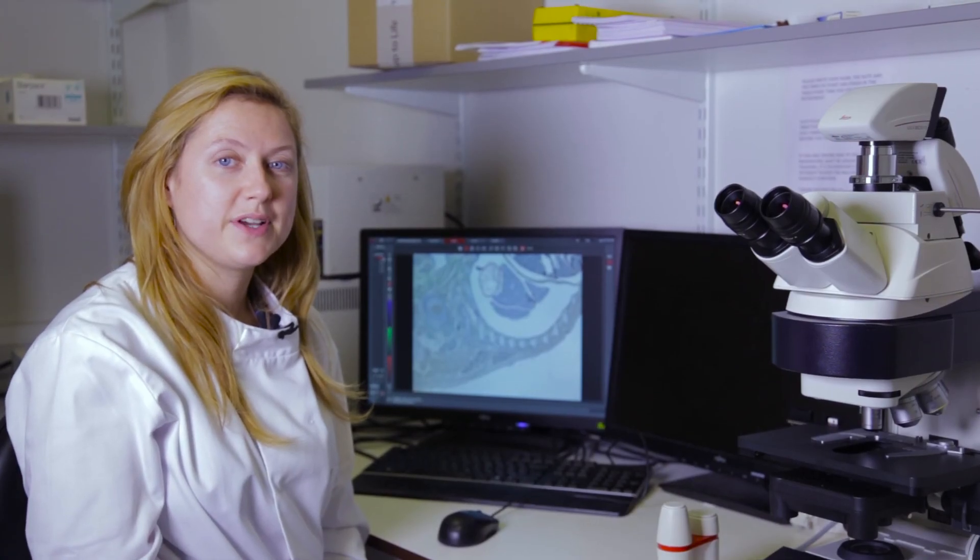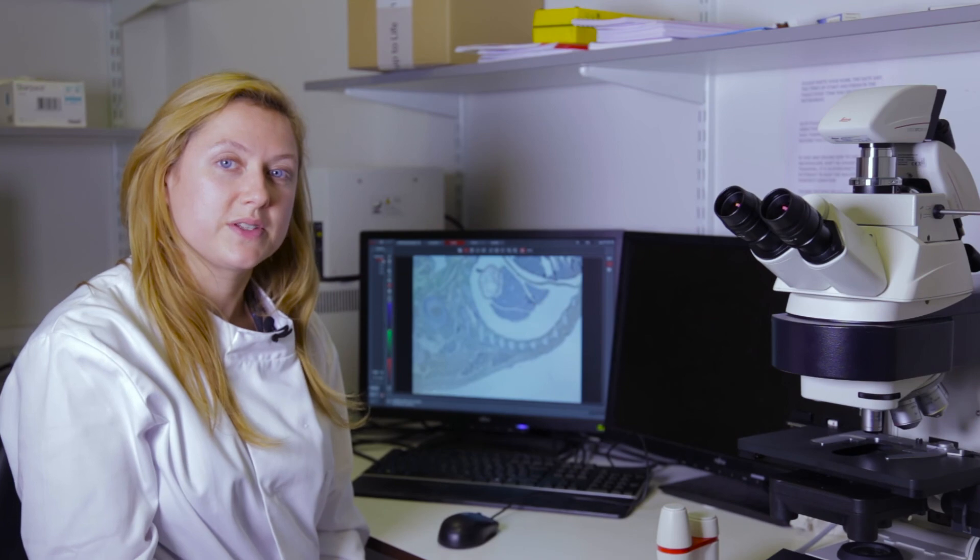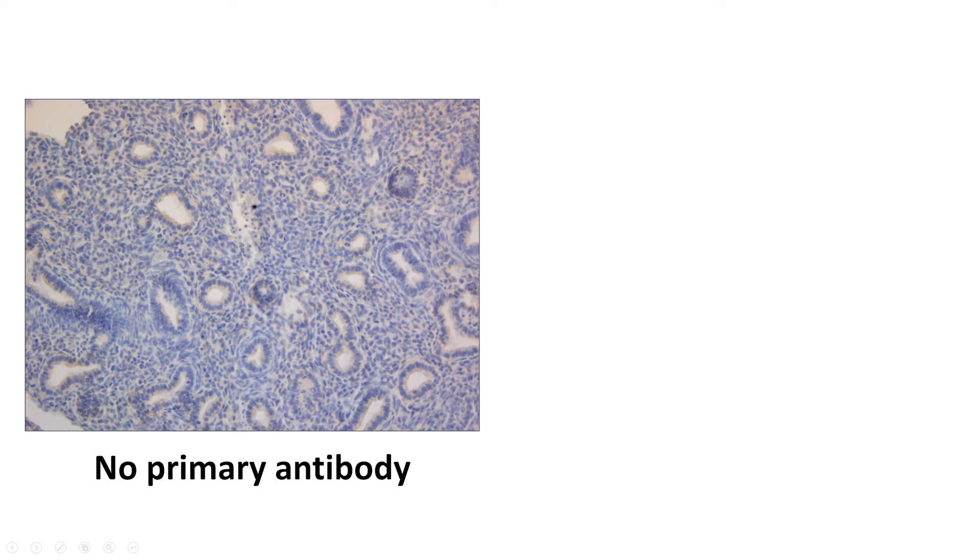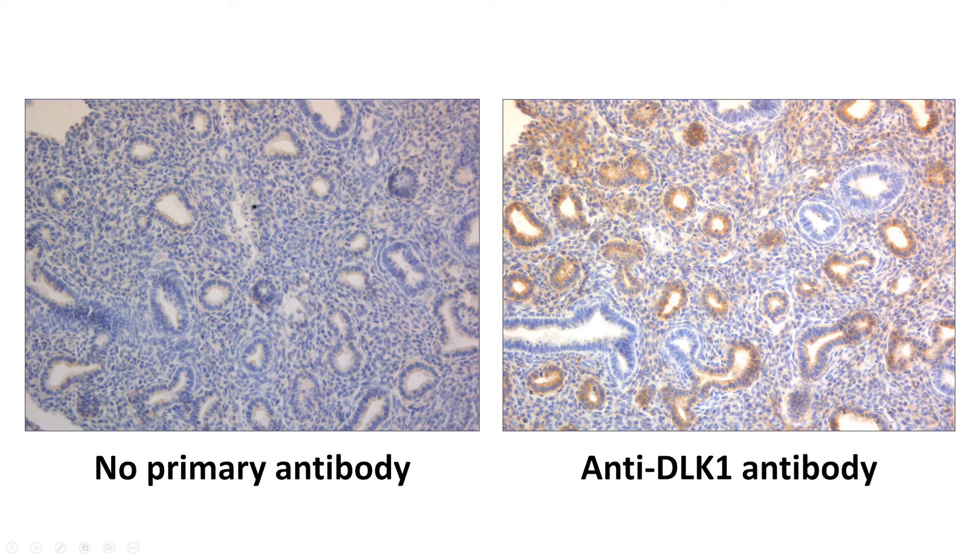Once the slides have been left overnight to dry, they can be viewed using a microscope. Here you can see the negative control, which has no brown staining as it had no primary antibody added to it. Next to it, you can see the experimental slide, which does have brown staining in the places that DLK1 is expressed. Both slides have blue staining from the haematoxylin counter stain.